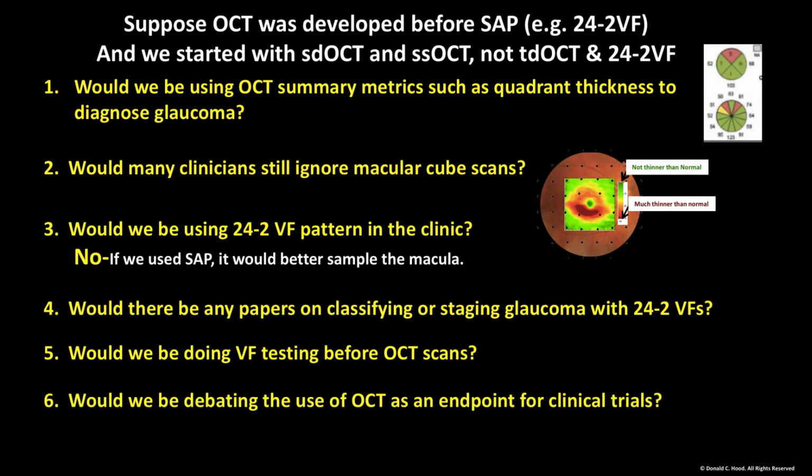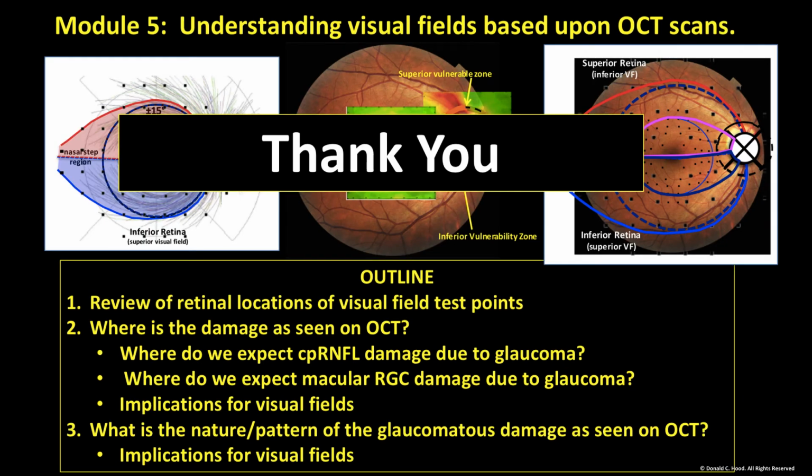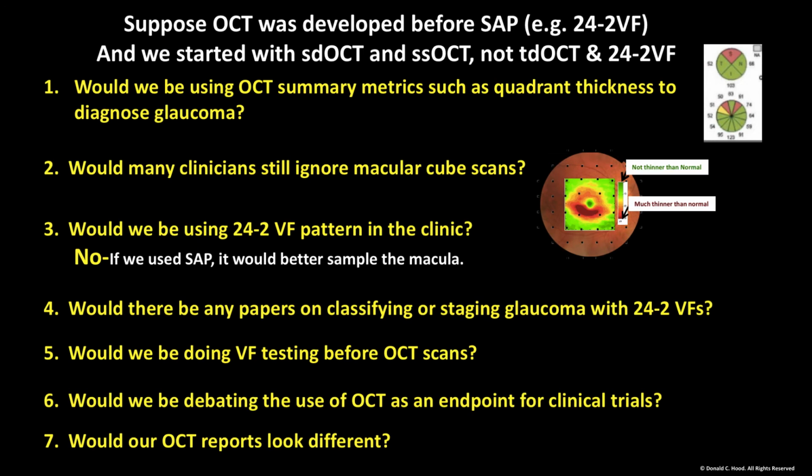Would we be debating the use of OCT as an endpoint for clinical trials? Again, I do not think so. Finally, would our OCT reports look different? And the answer is yes, and that was the topic of earlier modules and will be the topic of the discussions in the next couple of modules.